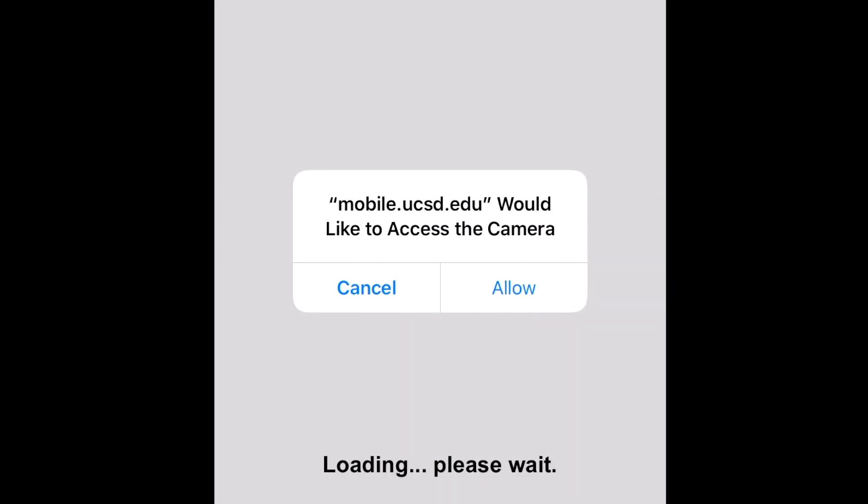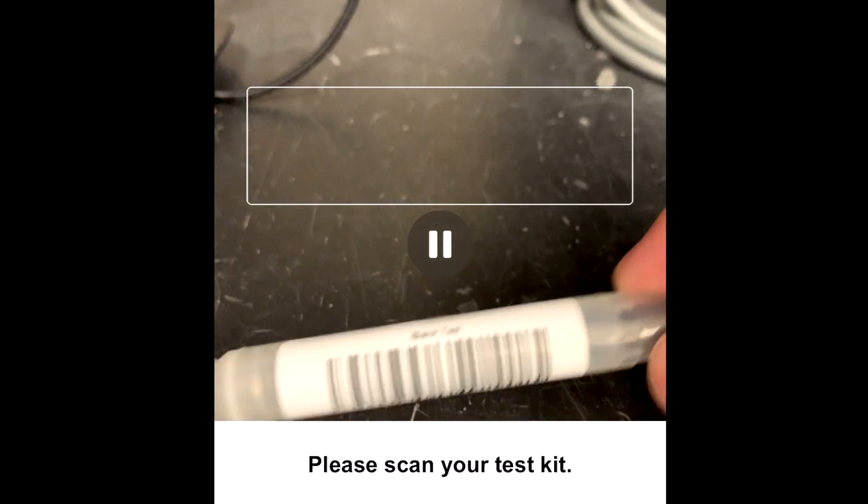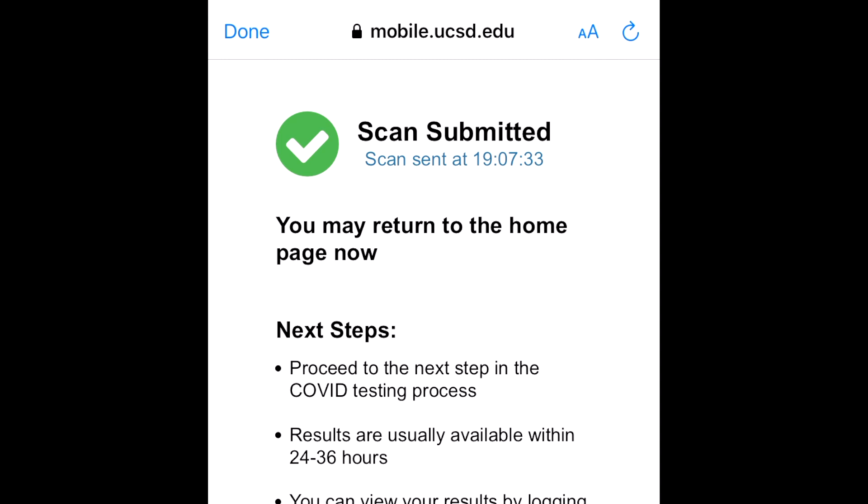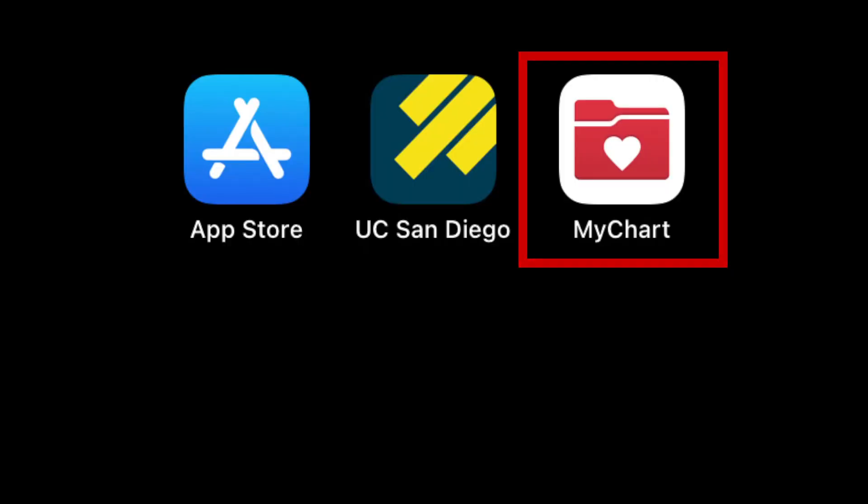Allow access to camera and center the barcode within the white box. Once you see a green check mark that says 'Scan submitted,' you're done. Make sure you have activated My Student Chart — this allows you to directly get your results.